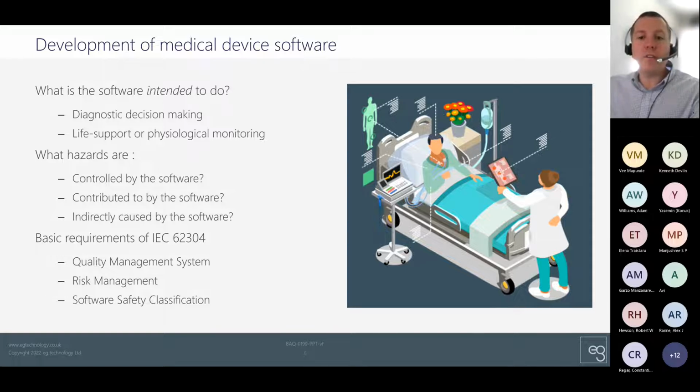When you're considering risks, it's legitimate to question whether the level of testing you can realistically achieve yourselves is likely to identify a flaw that hasn't already been spotted in the extensive testing that goes into something like Windows. So in some instances, the use of off-the-shelf software is actually appropriate. It's actually a lower risk development route.